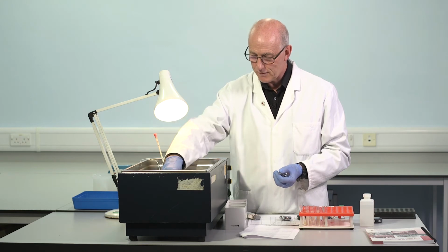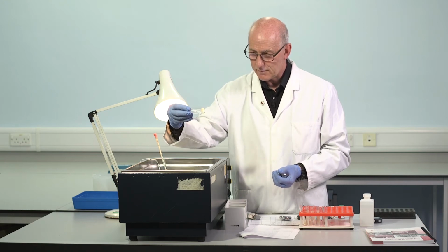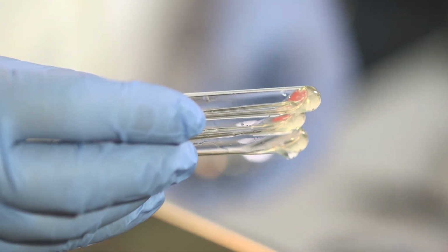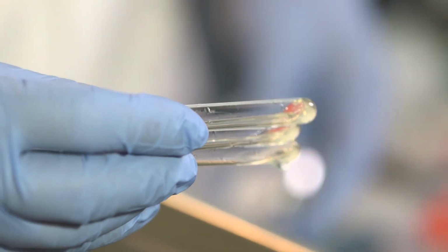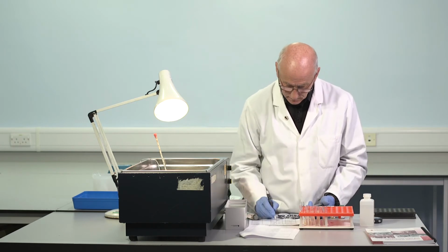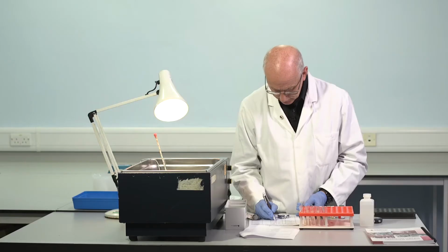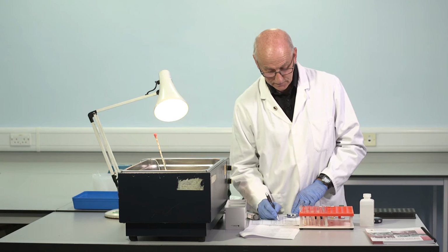Just waiting for the third tube, third dilution, and it's gone. So we've got clots now in all three dilutions. Progressively longer times, more diluted, progressively lower concentrations of factor VIII. Clotting times on test number 2. First dilution, 67 seconds. Second dilution, 70 seconds. Third dilution, 78 seconds. 1 in 10, 1 in 20, 1 in 40.